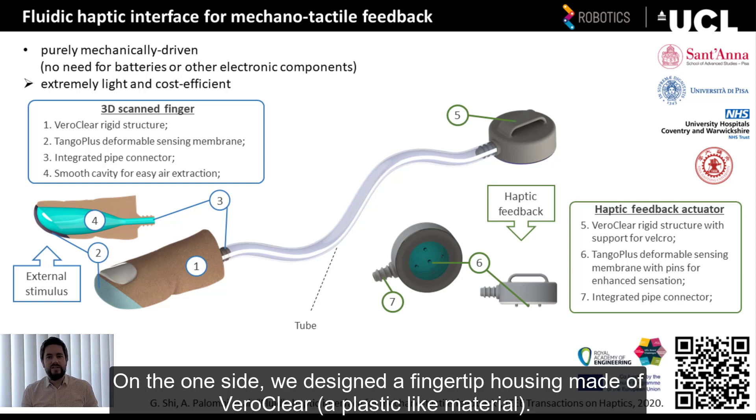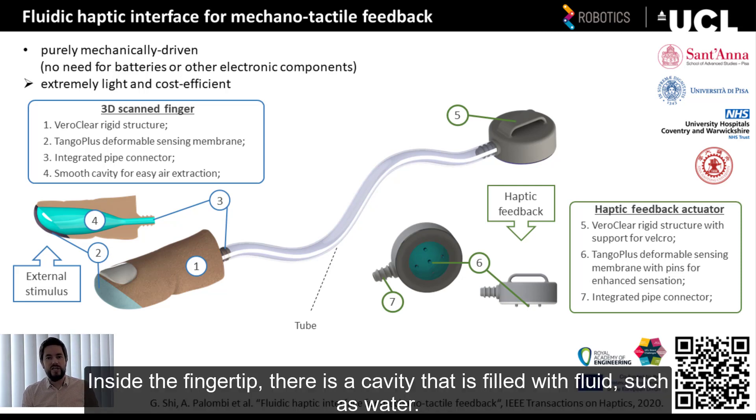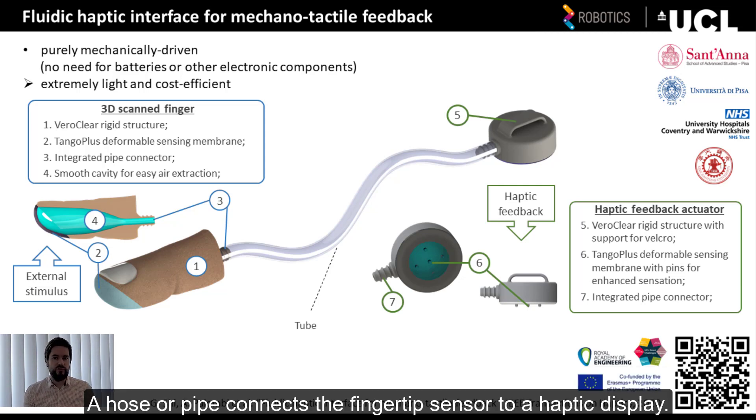On the one side, we designed a fingertip housing, made of Veroclear, which is a plastic-like material. The fingertip surface was printed using rubber-like material. Inside the fingertip, there is a cavity that is filled with fluid, such as water in our case. A hose, or pipe, connects the fingertip to the haptic feedback actuator, or display.